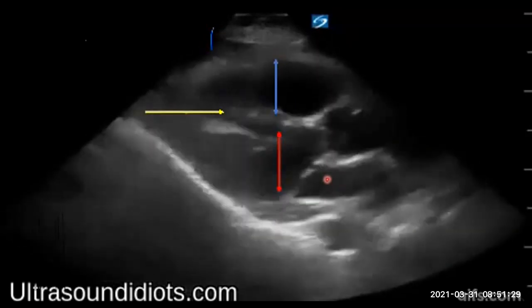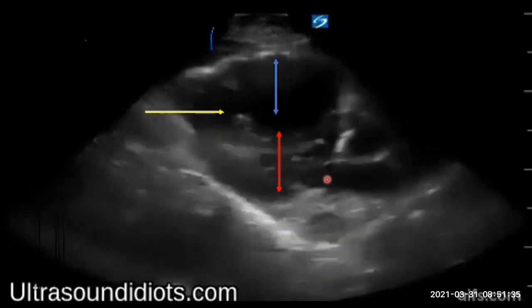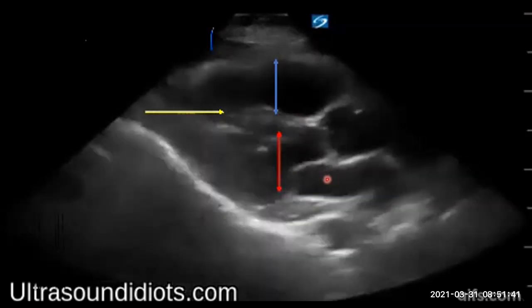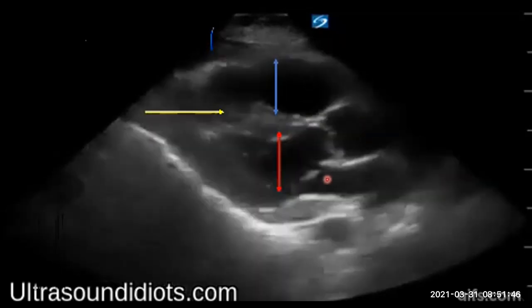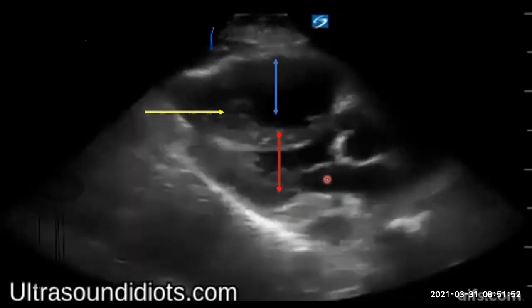In COAD, you don't have that. You have signs of ischemia if there's an ischemic component. But the most common thing you see is multifocal atrial tachycardia. That means when you look at your rhythm strip, you are looking at your P waves. You have a patient who's tachycardic with P waves that look completely different, at least 3 different types. Okay, and that's how we diagnose that. All right. So those are the 2 ways that you can differentiate the 2.